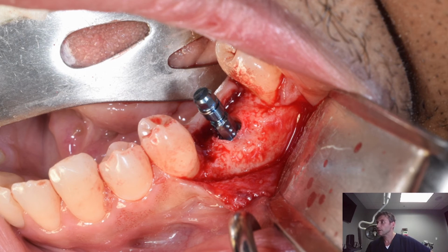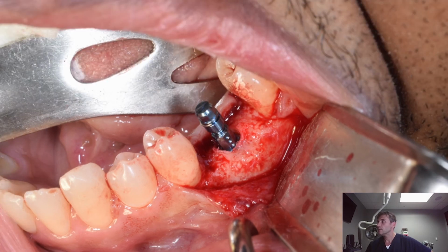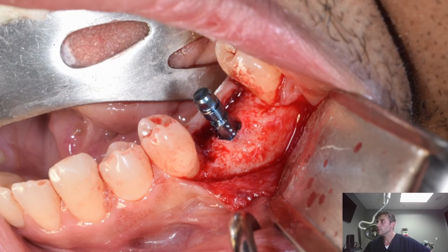This part right here is the implant carrier, and the implant. These are actually bone level implants, meaning the platform of the implant is here, and then the body of the implant is down here. It's inside the bone. And we actually bury everything in this scenario. We bury the implant, and we let it heal for typically 3 or 4 months. These implants undergo a process called osseointegration, meaning the bone cells will actually integrate to the titanium here and here.